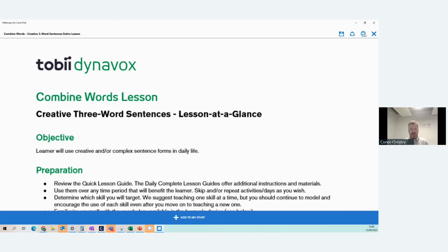So nobody's getting bogged down in programming, nobody's getting bogged down, oh, what will I do with this device, I'm not familiar with it, I don't know how to work the software. Just follow the lessons, and you're going to start making progress with the user. So it's a really, really nice tool to have, and it's free. So it's a good system to go with TD Snap.